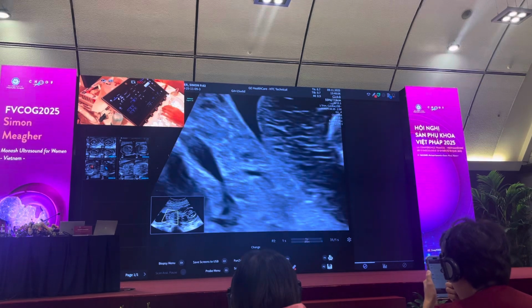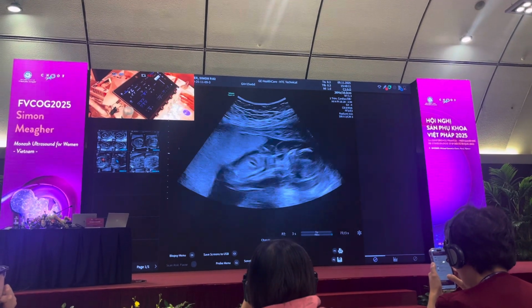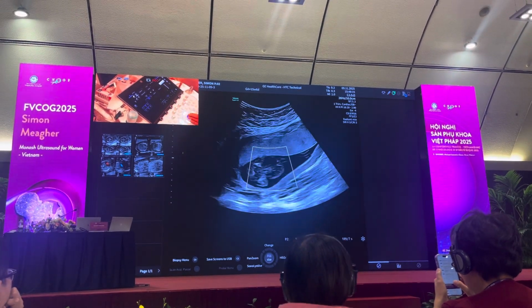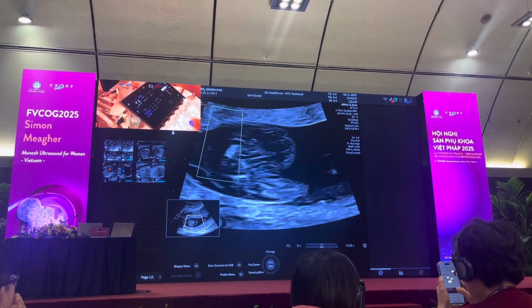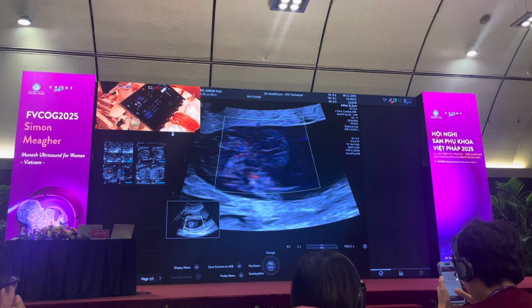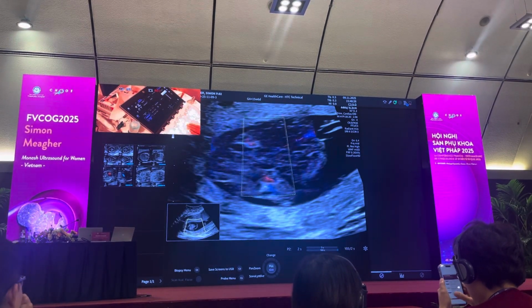I think the renal arteries are present and normal, but there's a duplex system on one side. Also important to check down the umbilical cord, just to make sure there isn't a single umbilical artery. So we'll come down to that, and also check to make sure both kidneys are present. You come on to that, put on colour, and again you can see both arteries. When you're looking at this, again, make sure that you are seeing a urinary bladder.